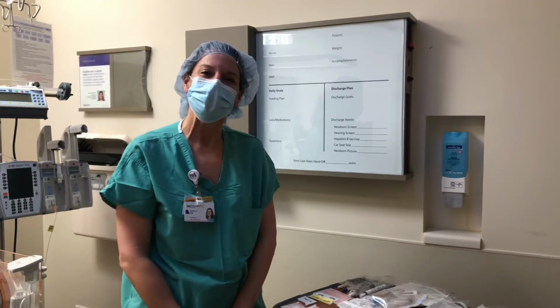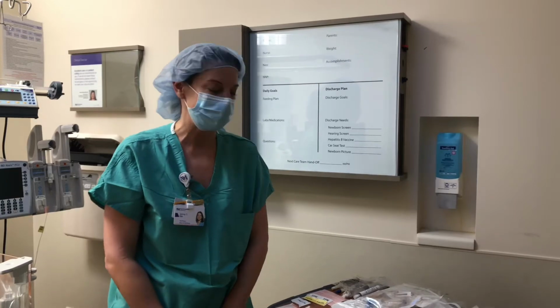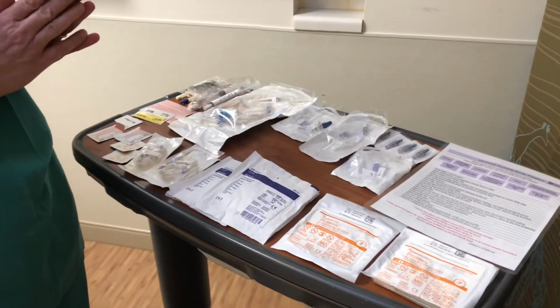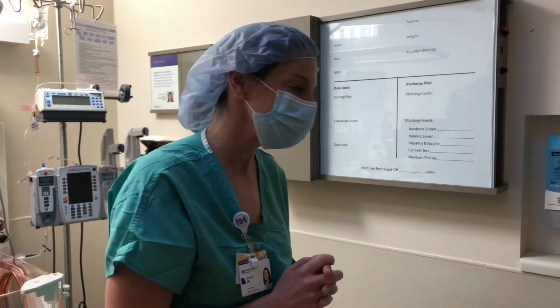Hi, welcome to part 2 of our special care nursery central line tubing change procedure. First, I want to show you our supplies that we've gathered here. Before you begin though, we want to perform proper hand hygiene before patient and equipment contact.